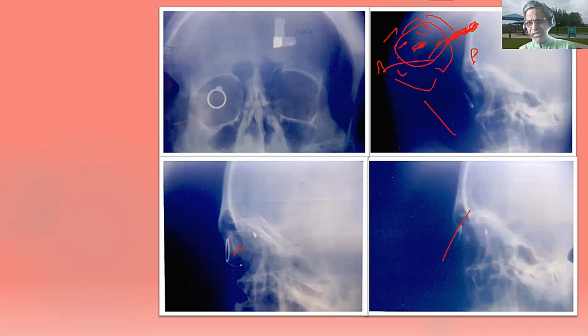If it is behind the center of rotation, it moves against. I told you the drawback: a foreign body at the center of rotation itself will not move. A foreign body outside the eyeball can still show some movement when fibrous tissue is proliferating. If you're asked to tell, tell it; otherwise don't, because they may not agree sometimes.